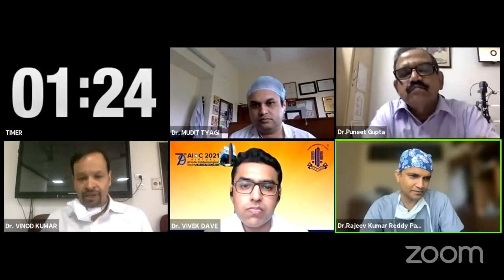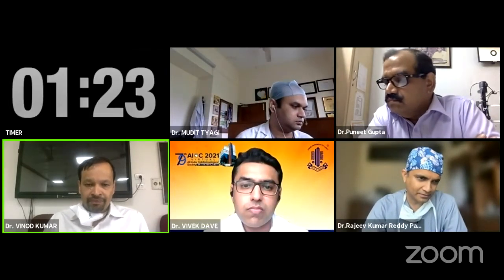Right. Thank you. Vinod, do you have something to say? I think working distance also matters. Once the working distance of the probe is very less, then you will have to go very close to the retina. That is the point when the illumination errors will occur. But if you adjust your distance in such a way, that will take care of this particular error.